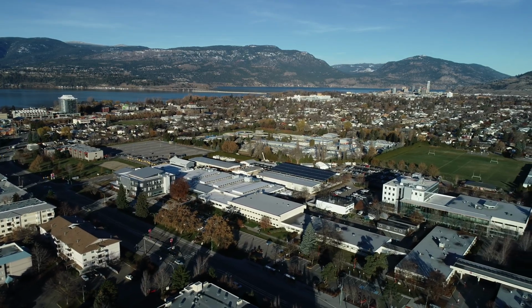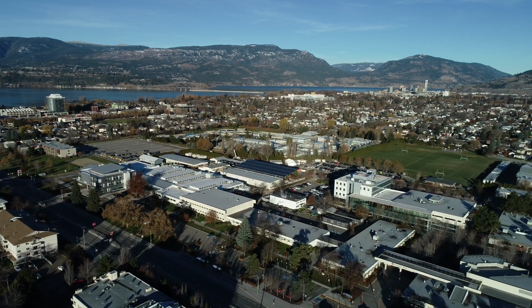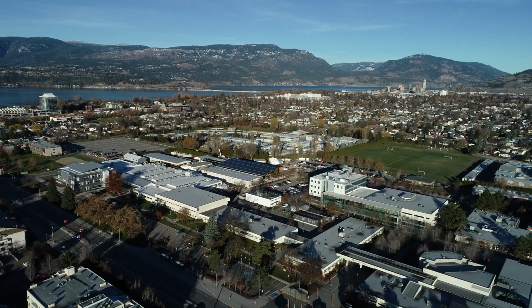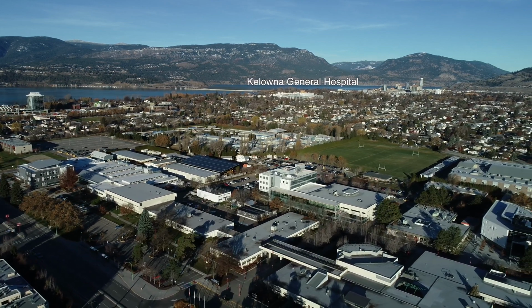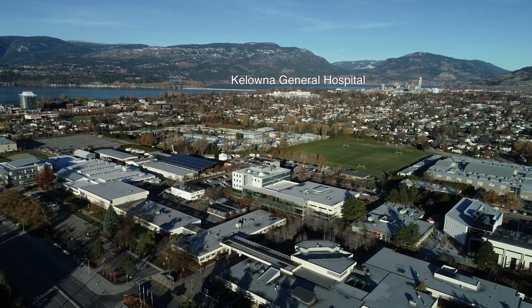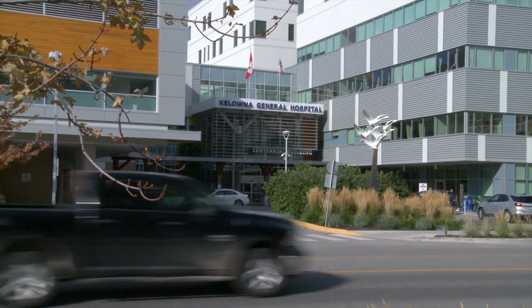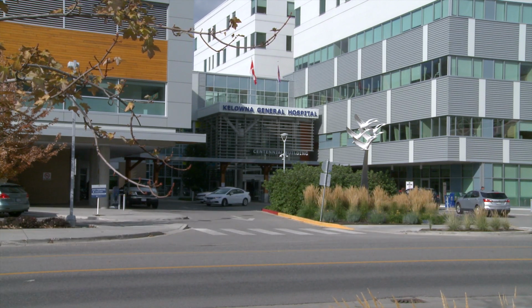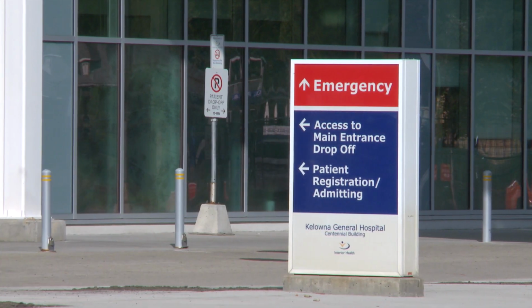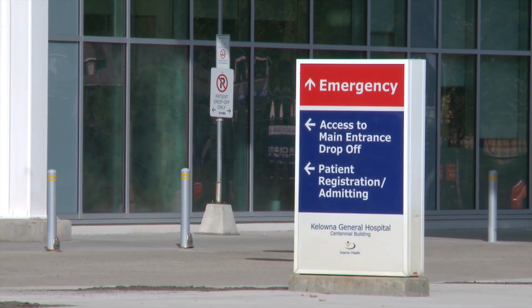An electrophysiology study, or an EP study, is a test used to evaluate your heart's electrical system and to check for abnormal heart rhythms. If your heart's electrical system is not working well, whether it's too fast or too slow, you may need a cardiac implanted device to help with either of these problems. Your doctor has ordered this test and you will come to the Kelowna General Hospital to have it done. If you feel unwell while waiting for your procedure, please contact your family doctor.